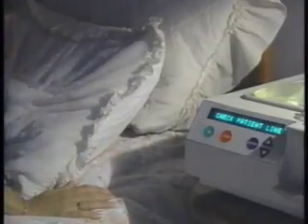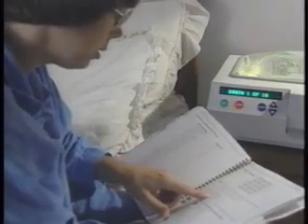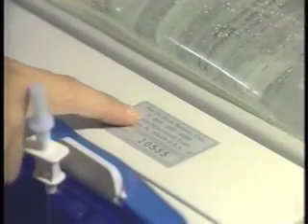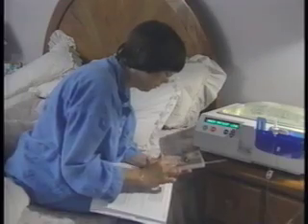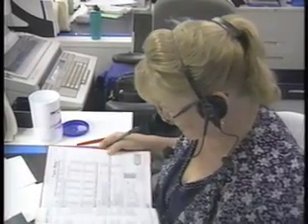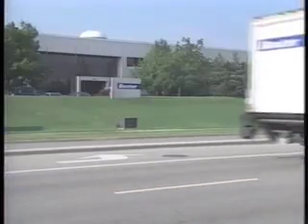The HomeChoice automated PD system is extremely reliable. Whenever the machine detects a difficulty, it will automatically stop the therapy, sound an alarm, and display the alarm detected until you resolve the problem. Press the stop button to silence the alarm. Identify the condition on the display and refer to the troubleshooting section of the Patient at Home Guide for helpful suggestions. If you have any difficulty resolving the situation, just call the Baxter 24-hour toll-free technical support line at 1-800-553-6898 anytime. If the difficulty remains unresolved, the representative will arrange for a new system to be delivered to your home within 24 hours in most areas.